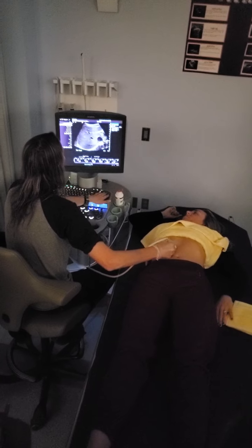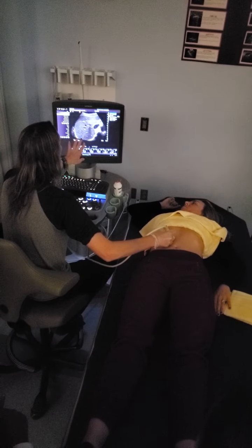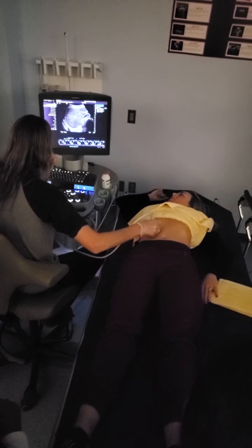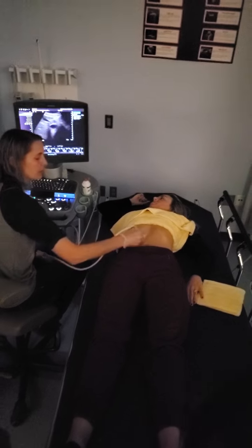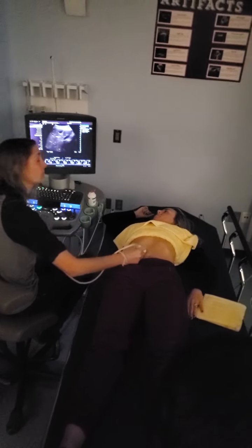Going to come down, we're going to see that main portal vein, and it's actually going to cross the IVC. We're going to add depth for this image. And then eventually we'll get down to kidney land, making sure that we have this border included. But she has that special window. Her special window works well, so I'm going to use the special window. Some people have the slidey window. Other times you can roll your patients and just try to get that liver to fall.